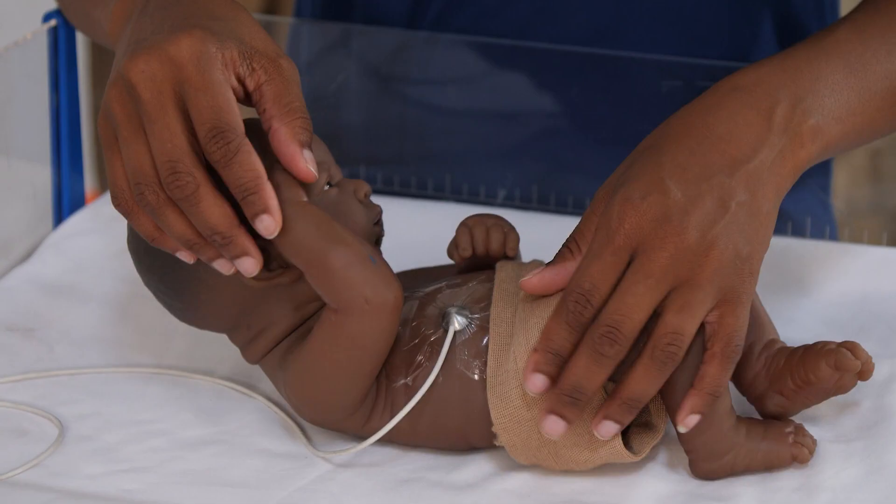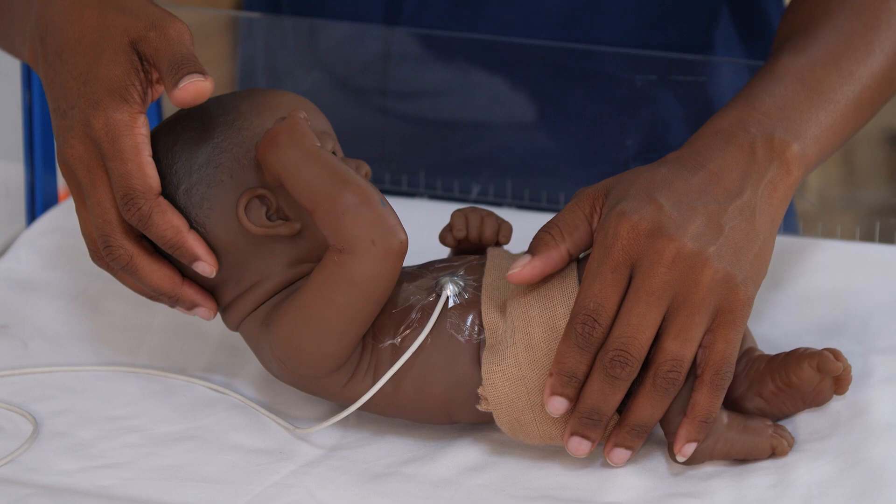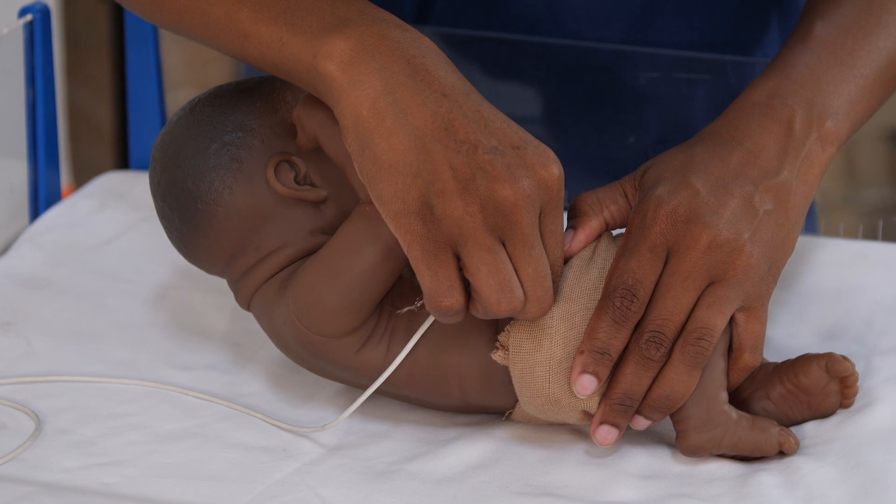When taking the baby off the radiant warmer, you're supposed to gently remove the probe. Make sure it does not cause trauma to the baby's skin. Take your time when removing the tape which holds the probe in place.